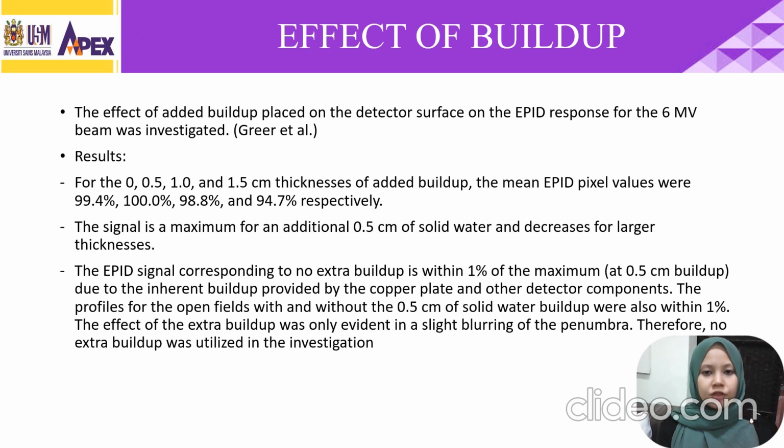The profiles for the open fields with and without the 0.5 cm of solid water buildup were also within 1%. So the difference is really low. The effect of the extra buildup was only evident in a slight blurring of the penumbra. Therefore, no extra buildup was utilized in these investigations.